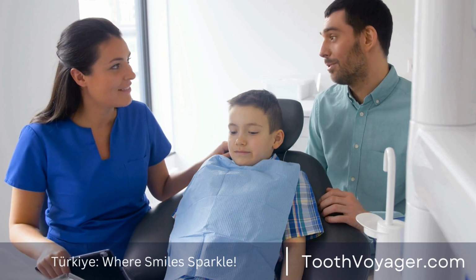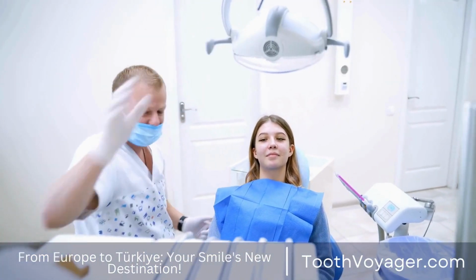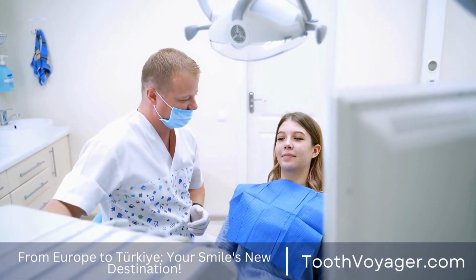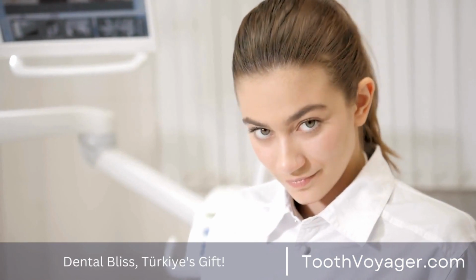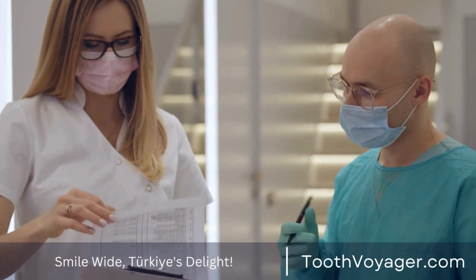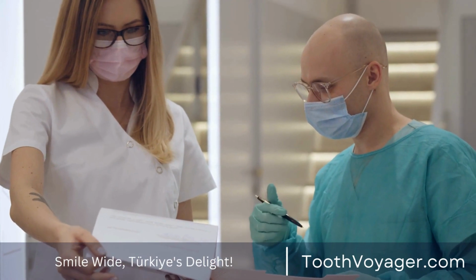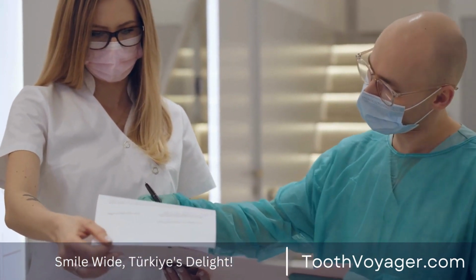What is a dental crown? Crowns that resemble teeth are cap-like devices that are put on top of teeth to restore their dimension, shape, strength, and appearance. They're made of many different materials such as porcelain, metal ceramic, and resin. Every material comes with its distinct advantages and disadvantages, which is why it's crucial to speak with your dentist in order to choose which material is best suited to your specific requirements.